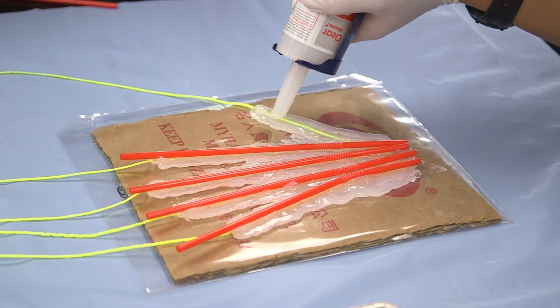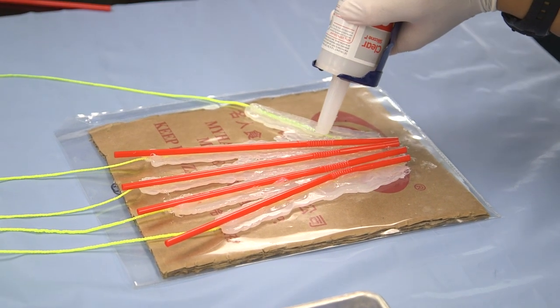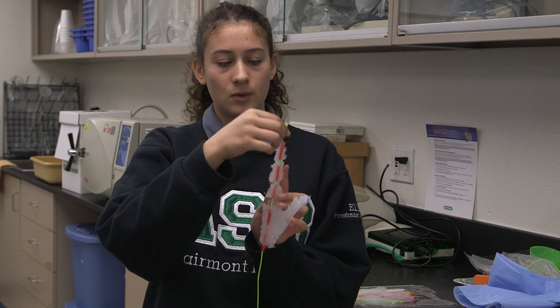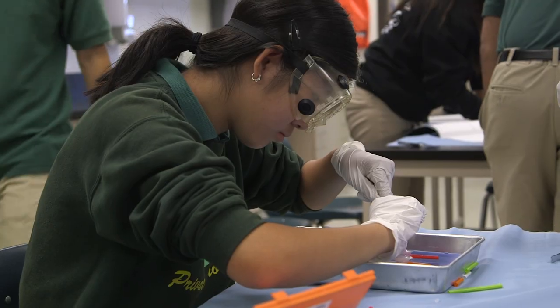Once we had the silicone mold, we had to figure out how to make the joints move. Some people used straw, some used string — there were multiple different ways to simulate a joint. We used dissecting tools to cut into the straw to create gaps, and then put the string through it with a bead on top so it doesn't go all the way through.